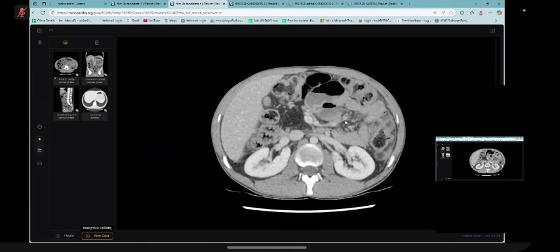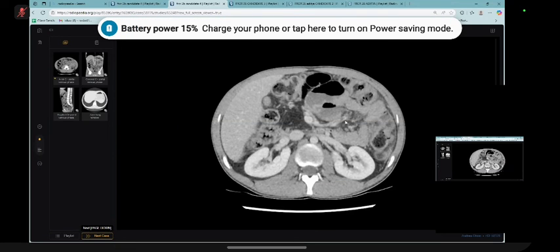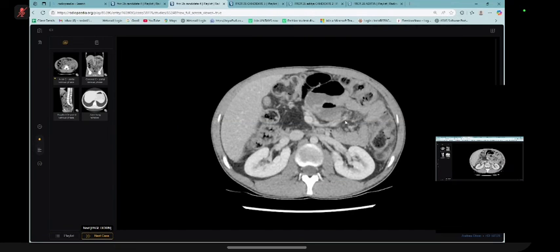And I would like to immediately convey this finding to the referring doctor, arrange an urgent surgical referral with a cystic fibrosis clinic review for this patient, and manage by enema and the treatment for cystic fibrosis. Yes, sir. All right, there is a separate cystic fibrosis clinic in the UK, so you can send that patient there, but you need to pick up these findings. All these cases are very important.